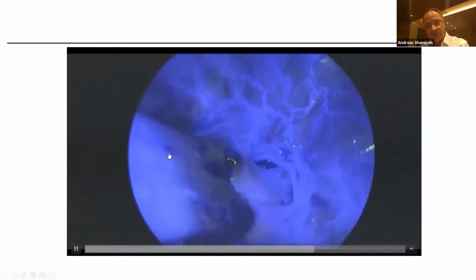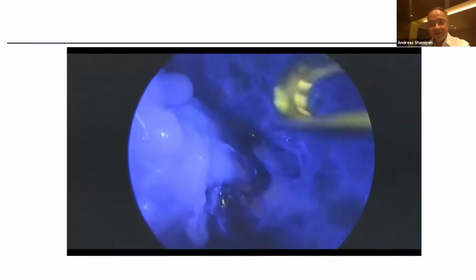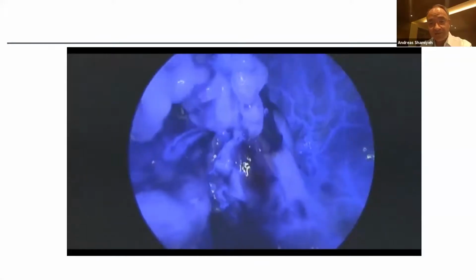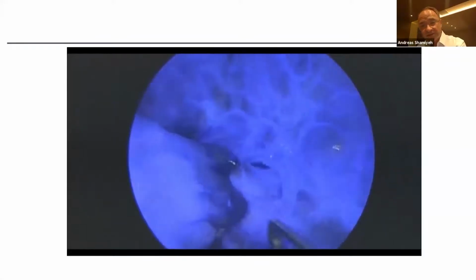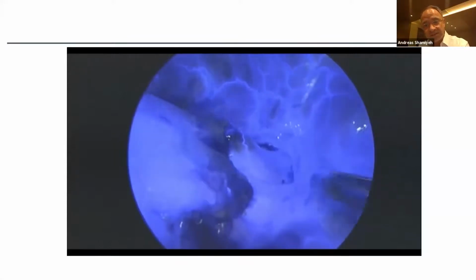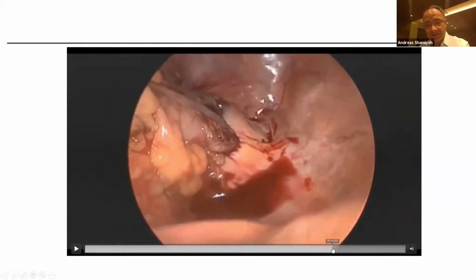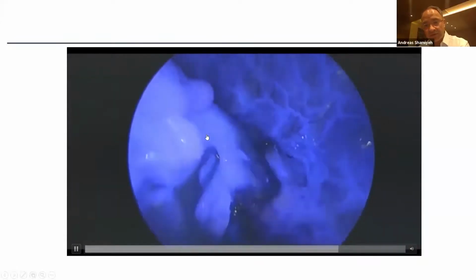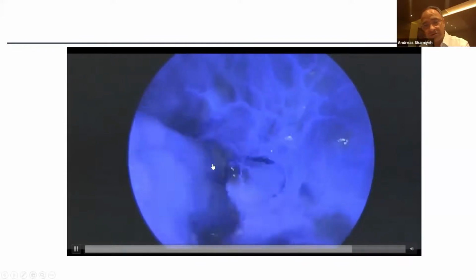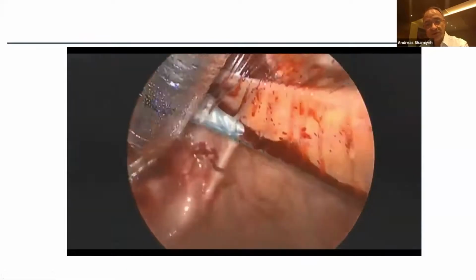So we had to do a redo of the anastomosis. And this is what is definitely worth taking your time for. It is better to do the ICG before the anastomosis, but in that case, we just had to do a re-resection. You can see the stump, perfect blood supply on the rectal stump, but no blood supply here on the anterior wall of the descending colon. In that case, you will have to do a new anastomosis.